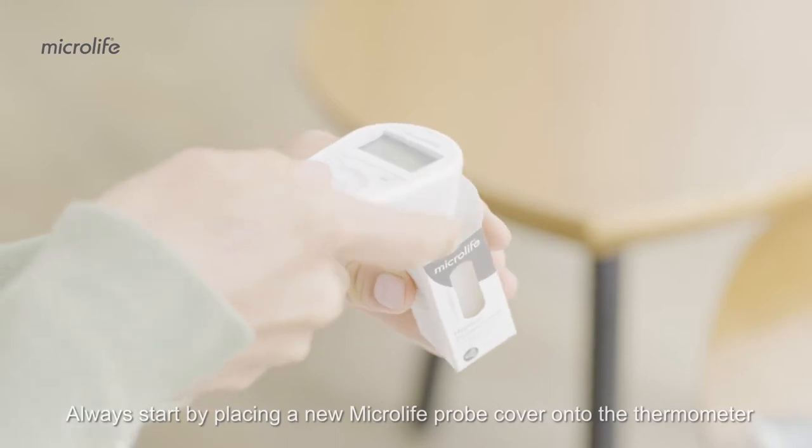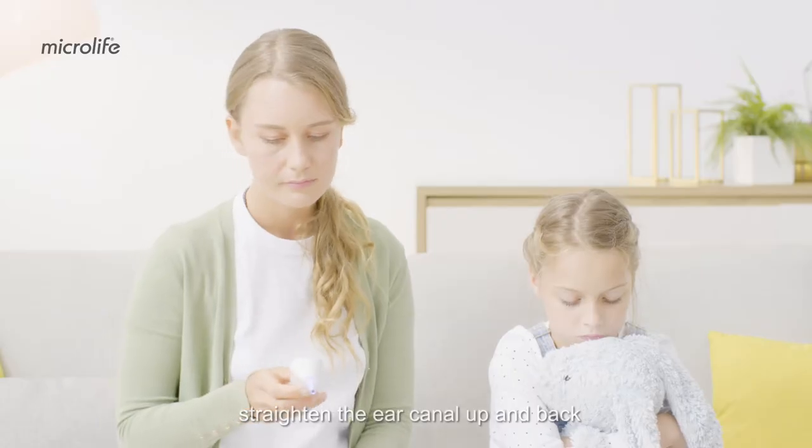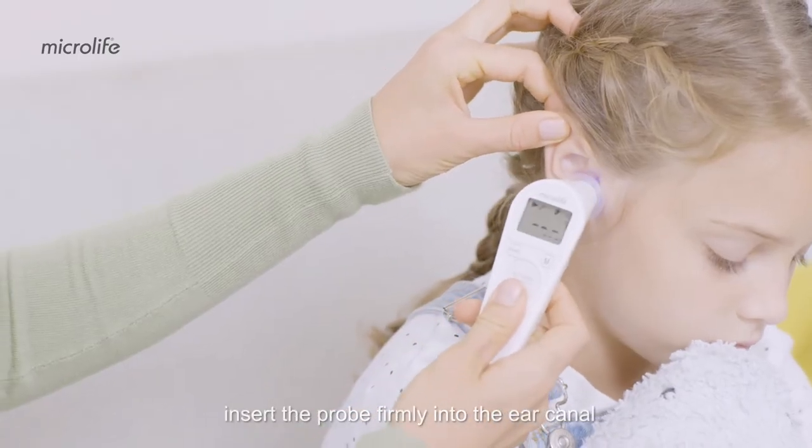Always start by placing a new MicroLIFE probe cover onto the thermometer. Straighten the ear canal up and back to give a clear view of the eardrum. Insert the probe firmly into the ear canal.